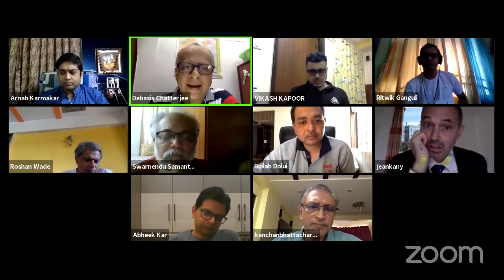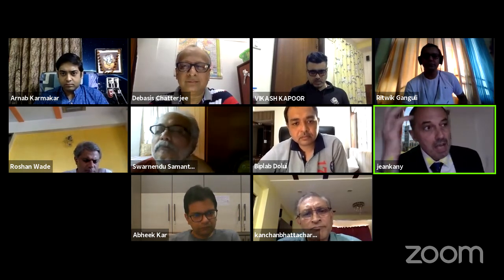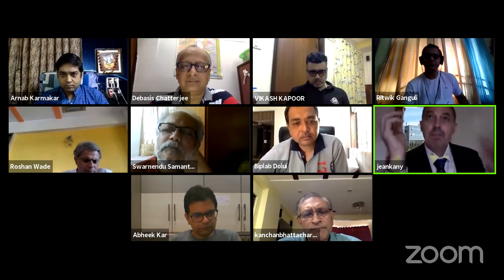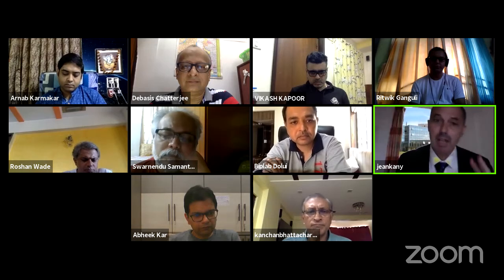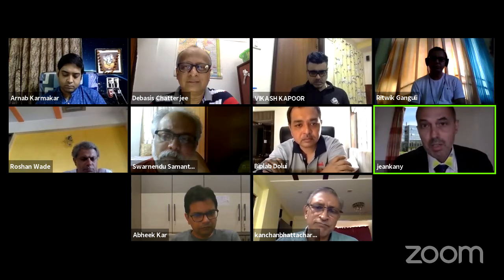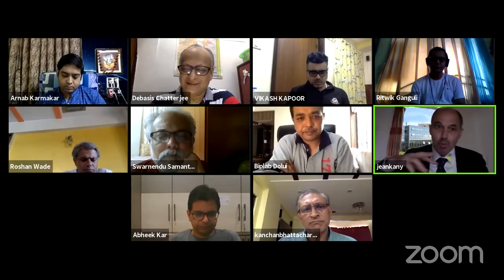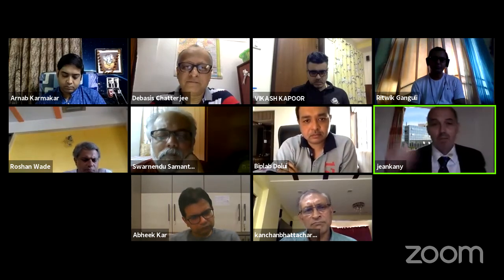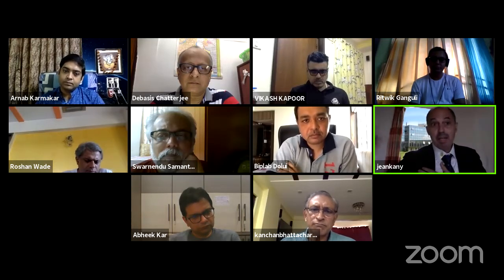Jean, you don't believe in this endobutton system of fixation for the graft? I believe in it, but I have just two or three comments. First of all, for me, it's more demanding because one button is demanding with lots of sutures. So two buttons, like Philippe Valenti, it could be a nightmare because you can mix things inside. We are using screws as we are orthopedics since all our lives. It's so easy with a screw. And the compression sensation is very important. The problem of a screw is the direction. And at the very beginning, you're afraid about the brachial plexus and your direction is not very good. But if you play external rotation with your shoulder, if you follow the technique, it becomes very, very easy.